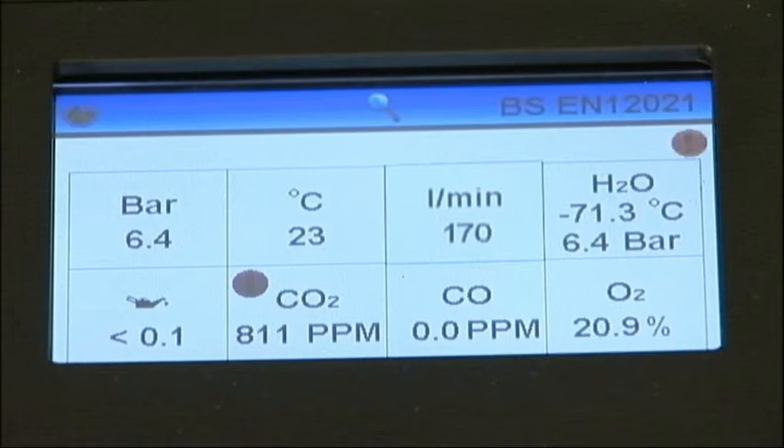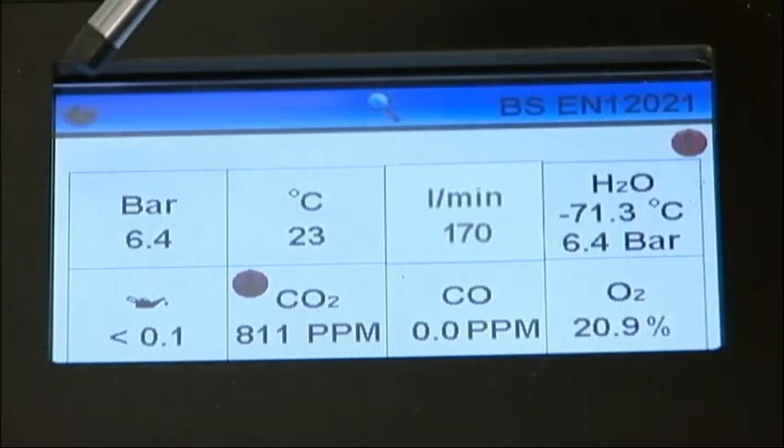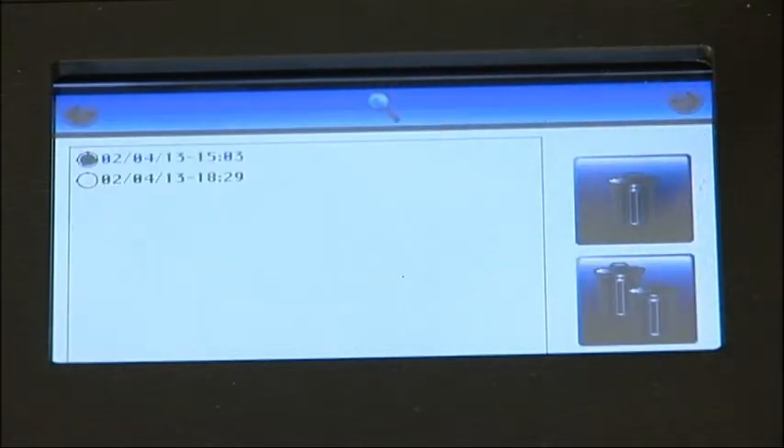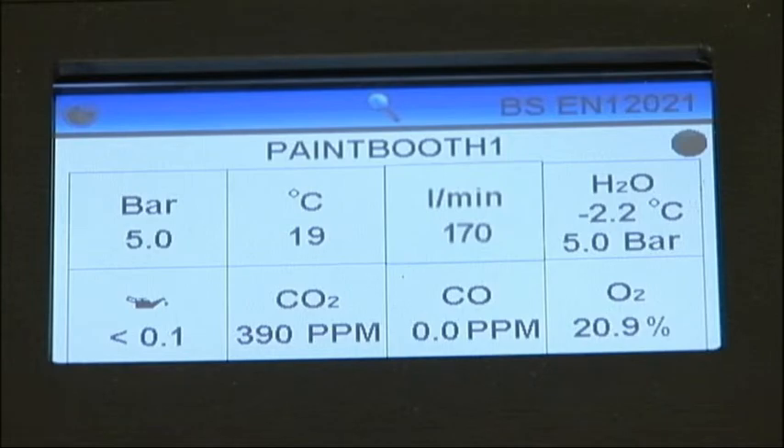This test result is automatically recorded in the instrument's memory, which can store up to 20 previous tests. Once the instrument has saved 20 results, you'll be unable to complete further tests until you've removed at least one stored test. To view these tests, return to the main menu and press the Review Tests button. Test results are stored according to the date and time they were completed, and from this menu, previous tests can be viewed or deleted as required.